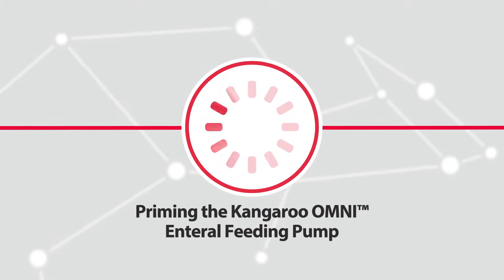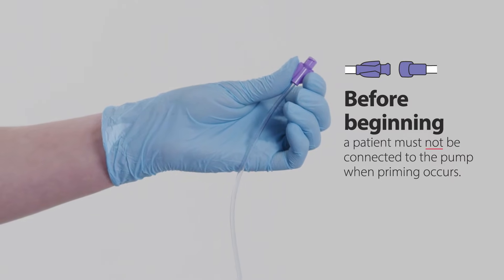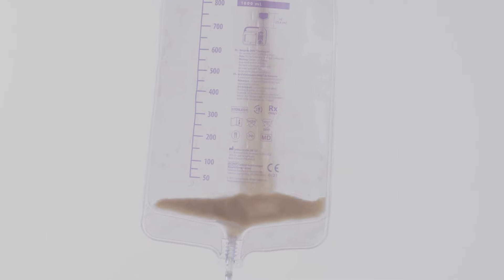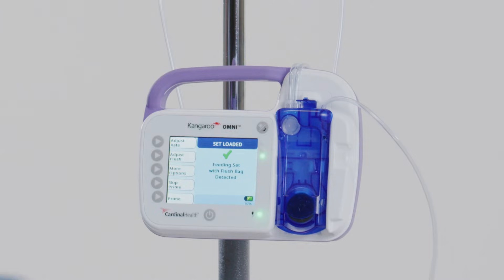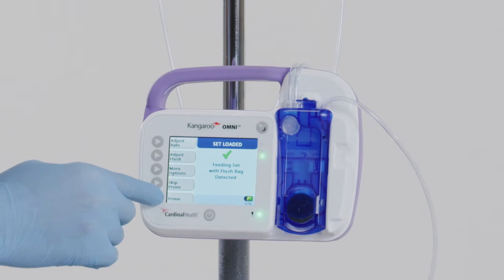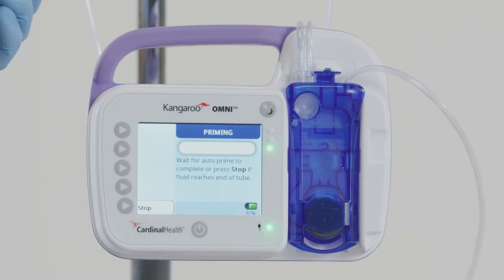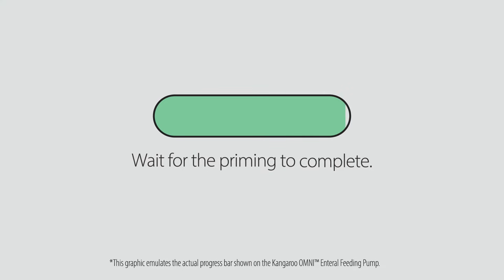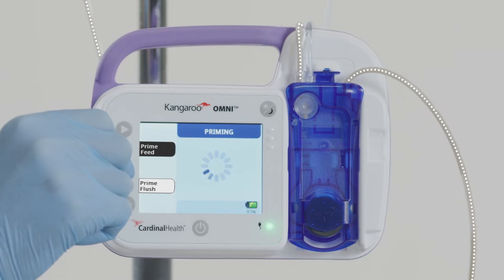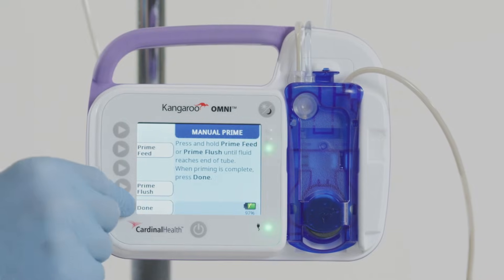Priming the Kangaroo Omni enteral feeding pump for feeding. Note that a patient must not be connected to the pump when priming occurs. To prime the feeding set, fill the bag with formula or connect to a pre-filled container. From the Set Loaded screen, press the Prime button. Select Auto Prime to automatically prime the feeding set or feed and flush set. The pump will show a progress bar indicating the automatic prime is in process. Wait for priming to complete, then press and hold the Prime Feed button until the enteral fluid reaches the end of the feeding set. Press Done to continue.